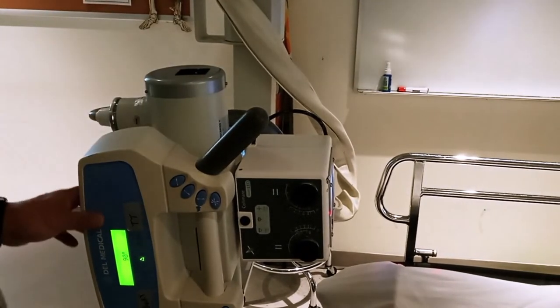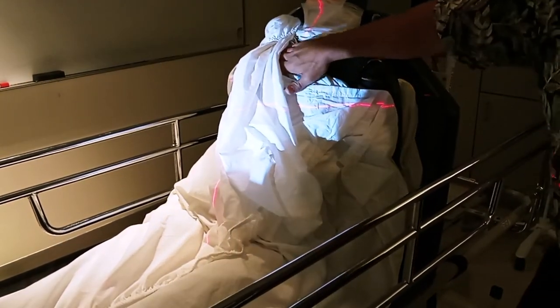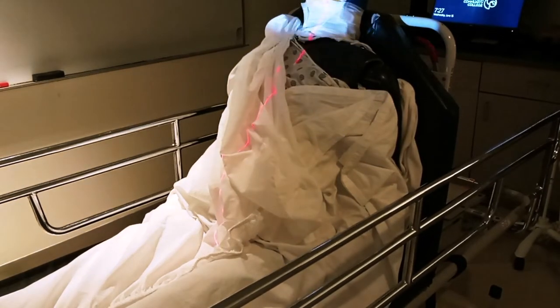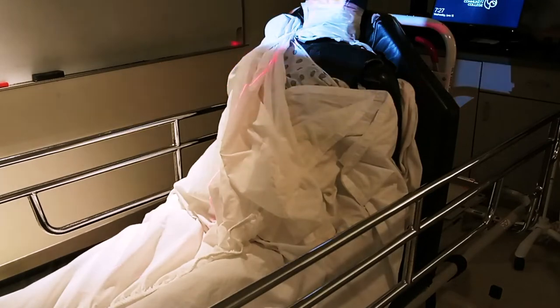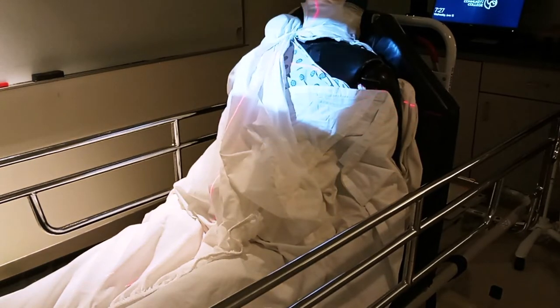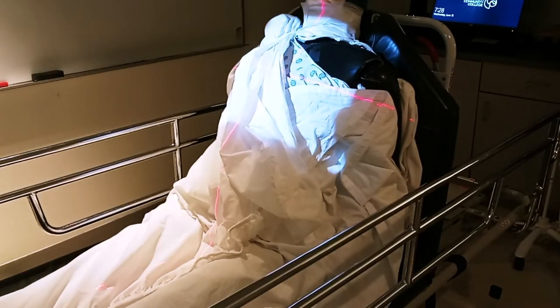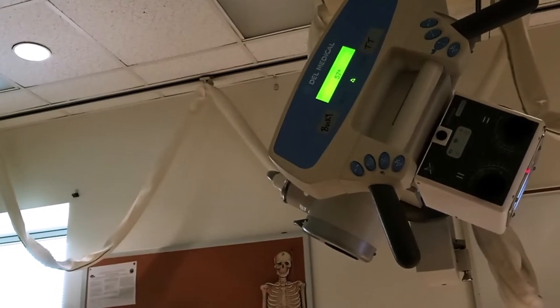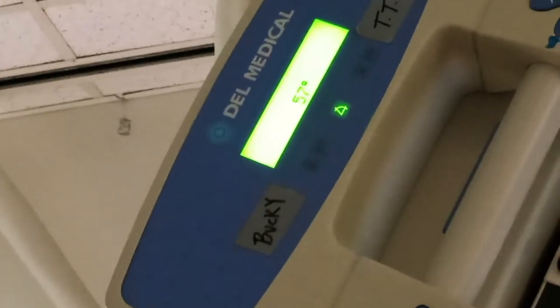We can fix that — I can angle my tube down. The patient's sternum is right here. If I put my hand on that sternum, I know I need a pretty steep downward angle to show the clavicular ends at approximately the level of T3. My intuition tells me an angle of about this is going to do what we need. I'll collimate here a little bit. Now we're pointing approximately at the level of T7 and perpendicular to the sternum — but look at the angulation on this tube.